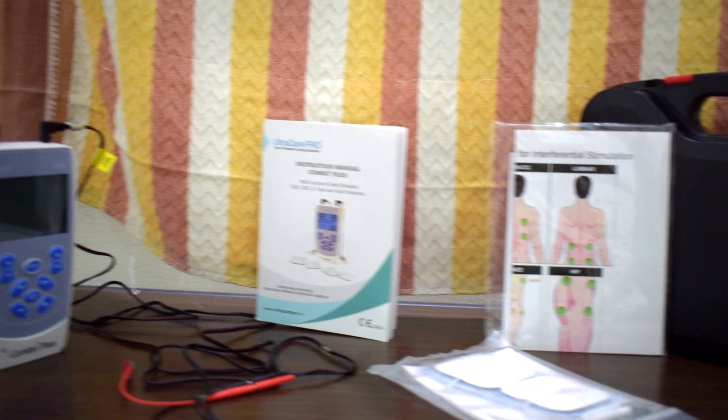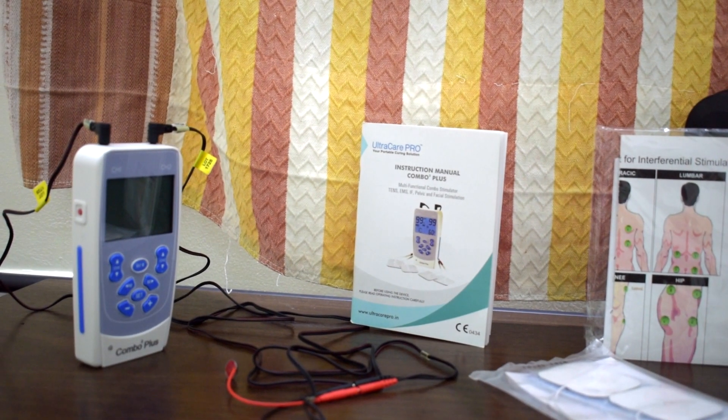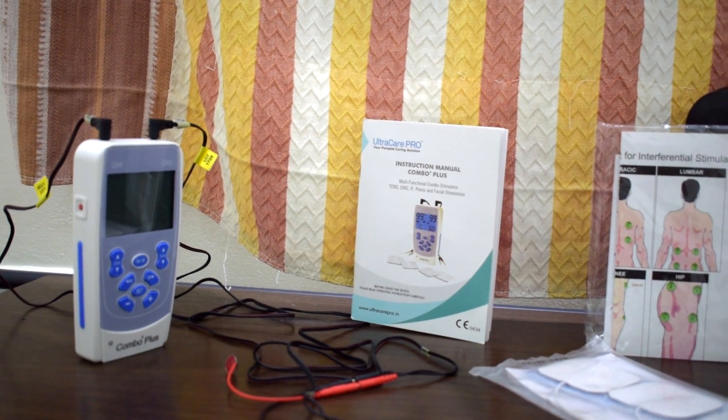Today, I am also going to show you how electrical muscle stimulation is applied to the facial muscles. I am using a device named the Combo 3 Plus by UltroCare Pro, which is a combination unit of IFT, TENS and EMS — an all-in-one device also used for electrical muscle stimulation of facial muscles. So let's see how I am using this.